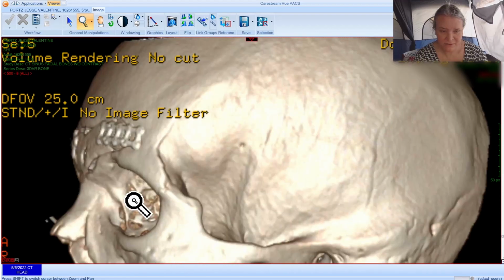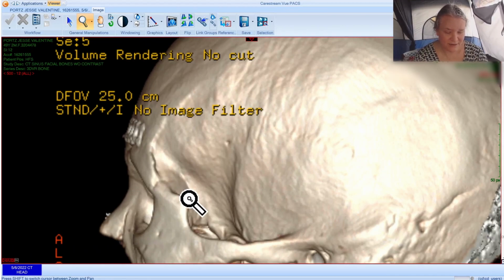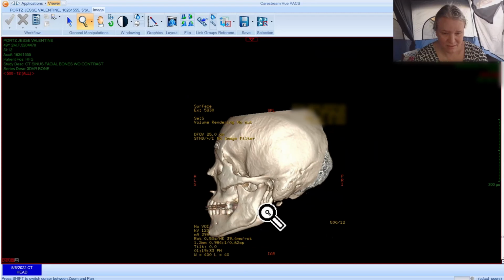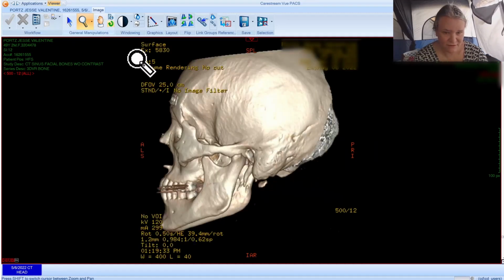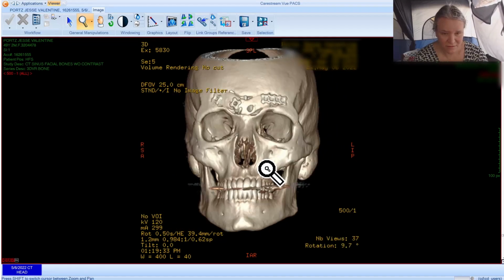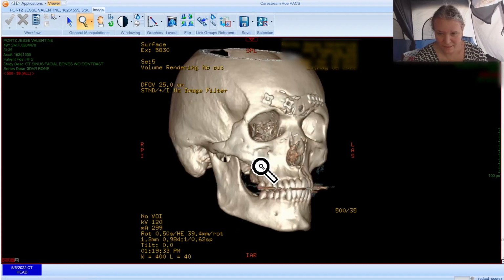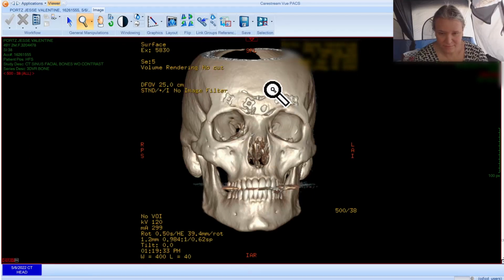Here we have the 3D view. You can see as it shifts around. This is radically different. Giving you the overall. So you can see portions of it are healed, but most of it still has a ways to go. Some of it's been pushed back a little bit. I mean, it's all been pushed back a lot, but it's a radically different profile.